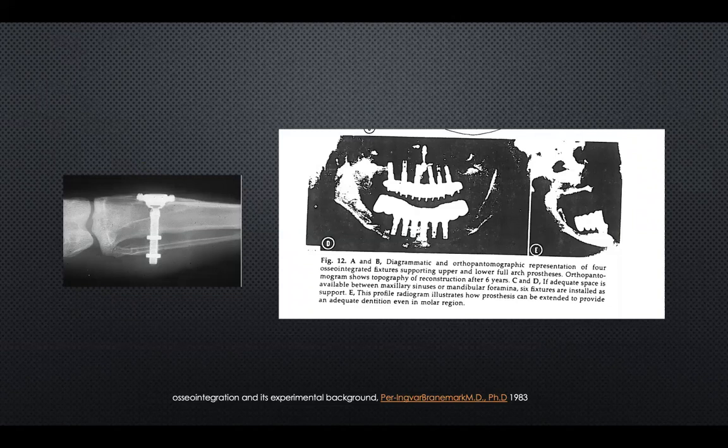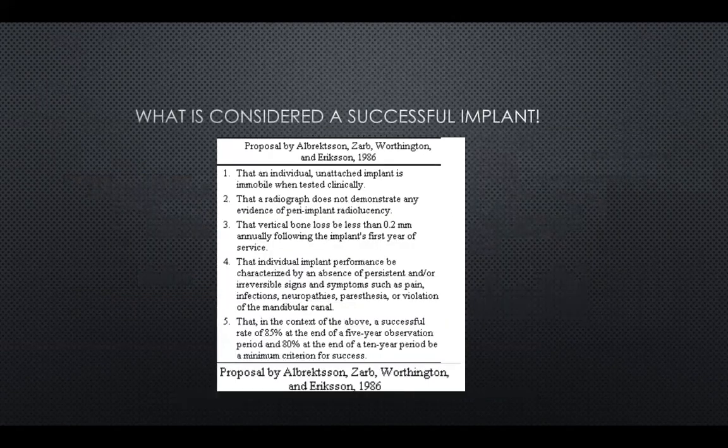And over the years, there became a need to classify the success of these implants. As more and more people started doing these implants, and started using them to do single teeth or fixed partial dentures, or what they call bridges, there became a need to classify what is a successful implant, and what it looks like.